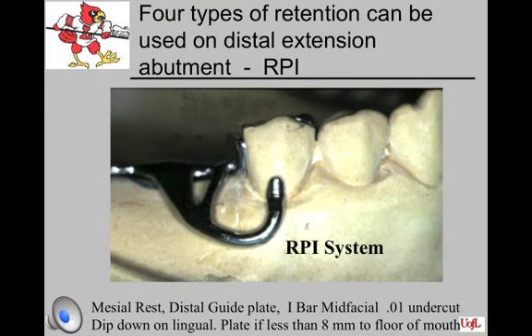The first and most preferable of the 4 systems is the RPI, as described by Arthur Kroll. The I-bar emerges from the base attachment area from a distance that is a minimum of 1 tooth length from the distal abutment, usually from a solid bar of the base attachment, so that it casts with better accuracy. At its origin, it is wider and tapers to its terminus. It runs horizontal to the crest of the ridge, and as it exits the acrylic resin, it is approximately 2 to 2.5 millimeters in width.